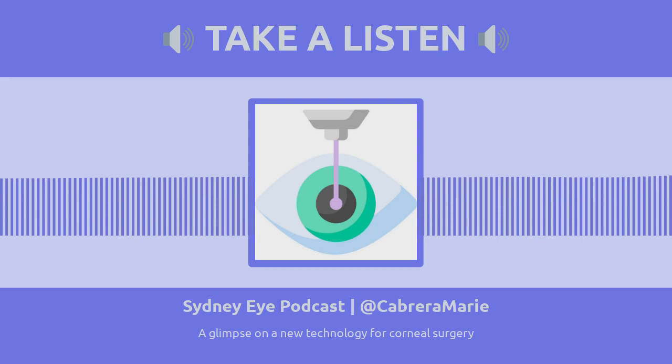In summary, this technology uses a patch which sticks very strongly to the cornea upon laser activation, sealing full thickness corneal wounds up to 6 millimeters in size. Possible applications of this technology include closing leaking, penetrating corneal wounds after routine cataract surgeries, closing traumatic corneal lacerations from battlefield injuries, and replacing sutures during corneal transplantations.